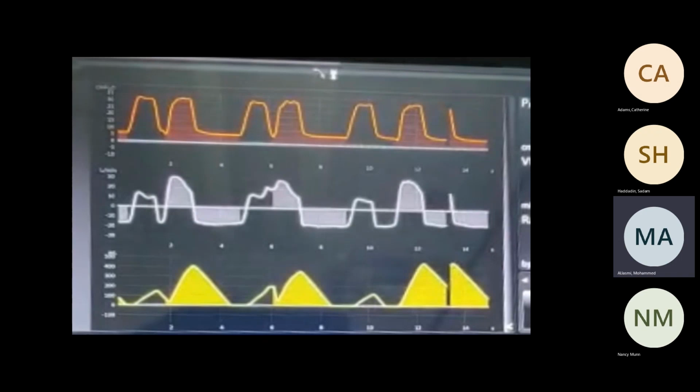What does that mean? I think it's IMV because in the first one it's by the patient itself, and in the second he's trying to breathe. Try to breathe before the machine finishes. So in this one the machine started, not the patient. That's early cycle.